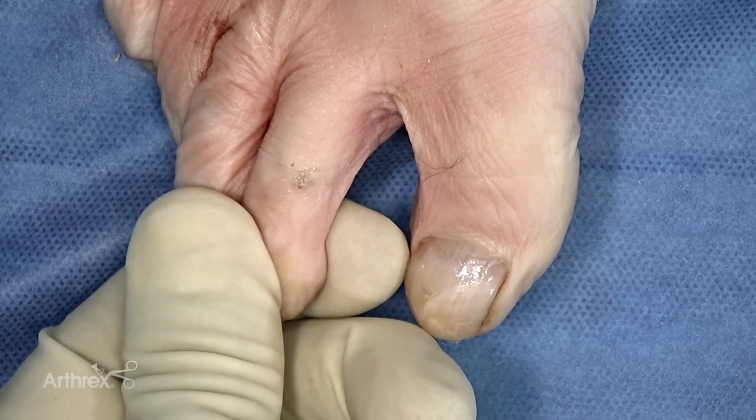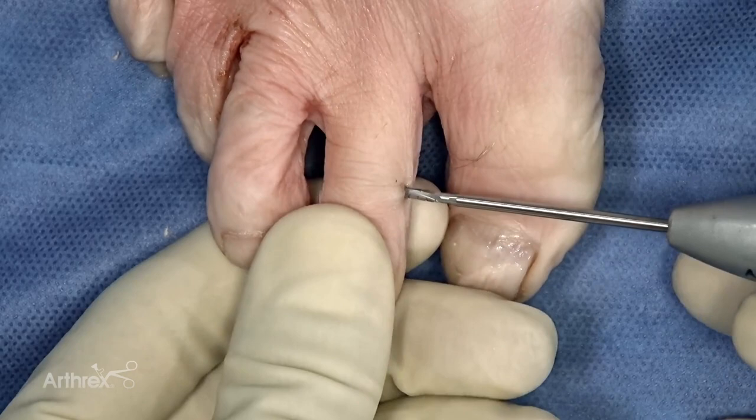You can see our incision is very small. It's right there, and I put my burr right into the center point or midpoint of the incision. I make sure I'm palpating for the dorsum of the extensor tendon.